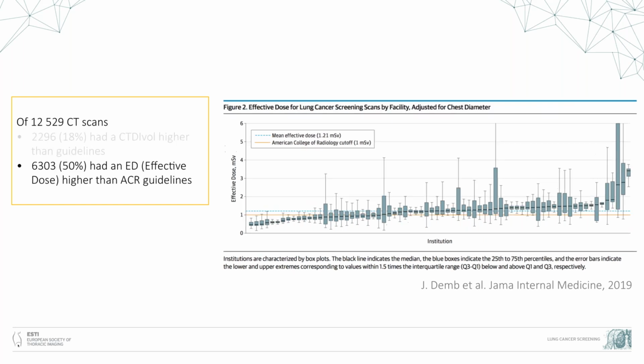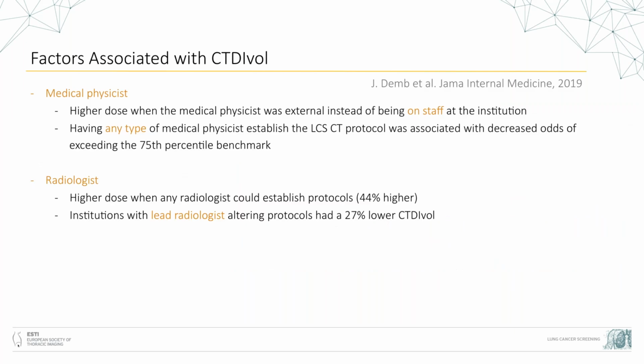And then when they looked at the effective dose, 50% of the participants had an effective dose that was higher than the ACR guidelines. So why am I showing you this study? It is mainly because they also looked at the reasons why the dose was higher than allowed.